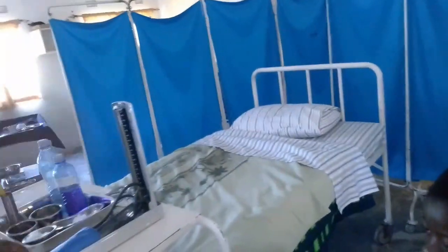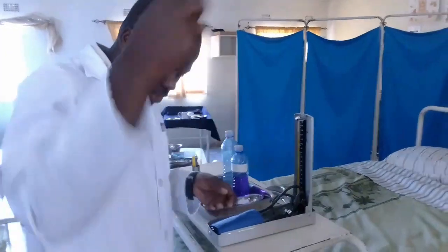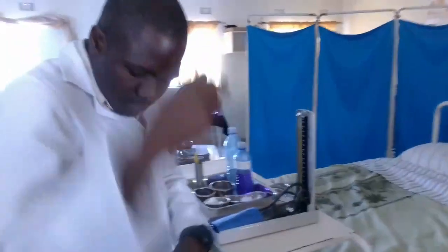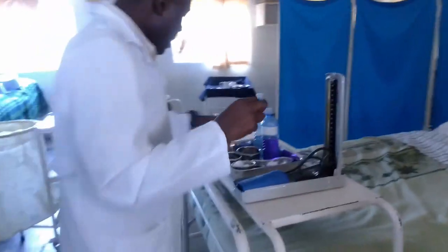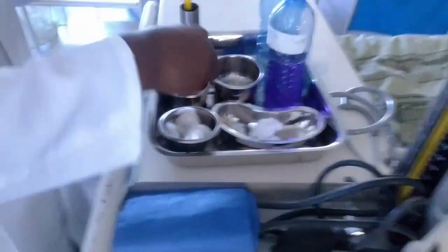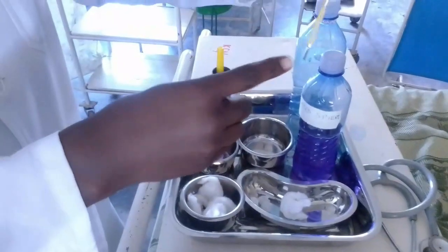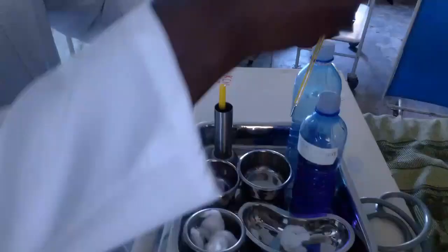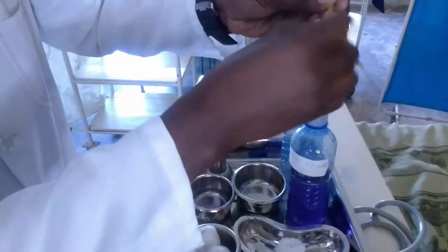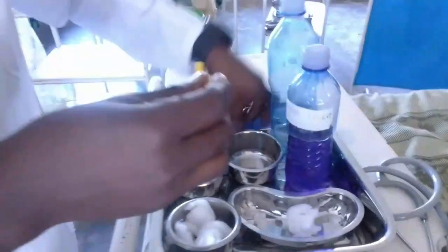Okay. So again, before you put it back, you need to shake it like that, and place it back there. But before placing it back, you need to get spirit now. That's spirit. This part is the dirtiest. When starting, you started from the bulb going up. So you start from there in a circular motion, then come down like that, and put it back.